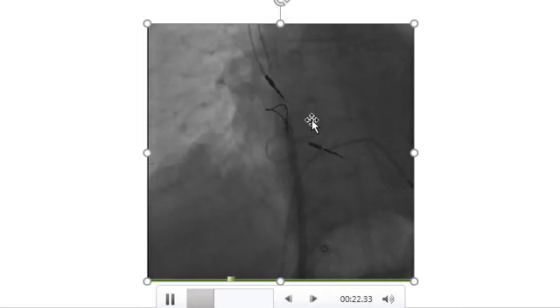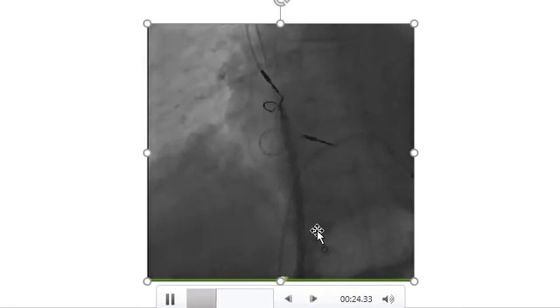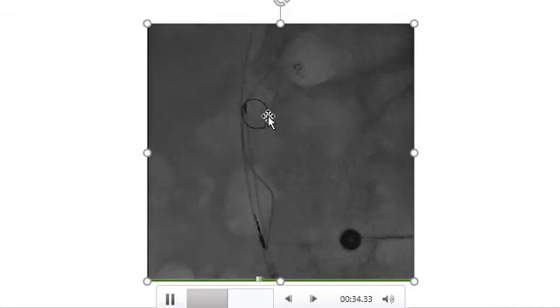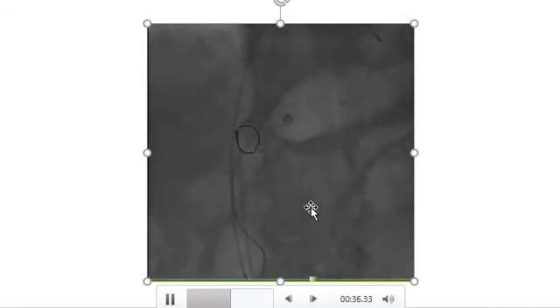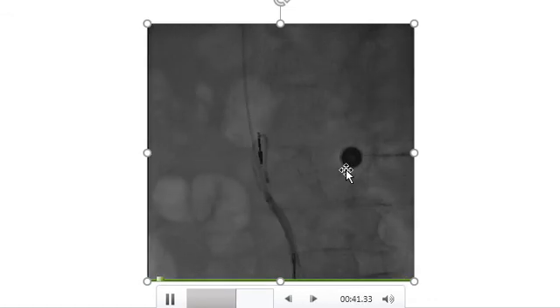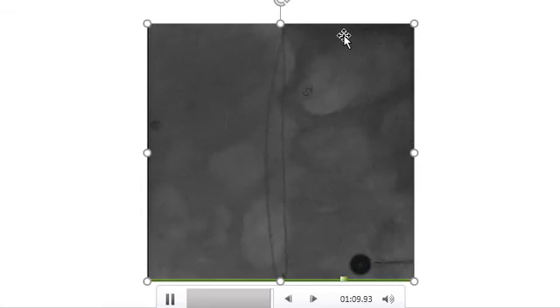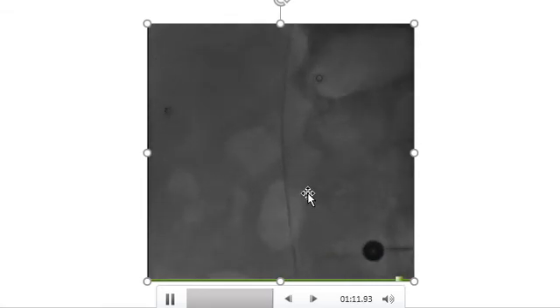Each lead was extracted into the Agilist sheath and extracted from the femoral vein access using a gooseneck snare. After making them free from the ventricle and atrium, it was straightforward to grab, snare, and extract them into the Agilist sheath. The only temporary pacemaker was left in place while the other leads were extracted.